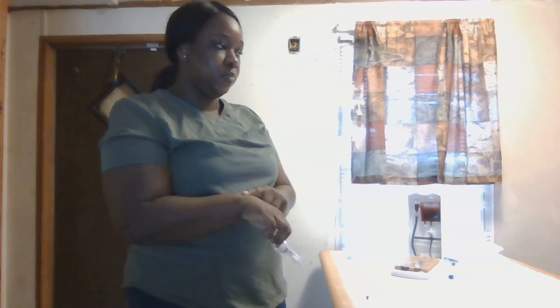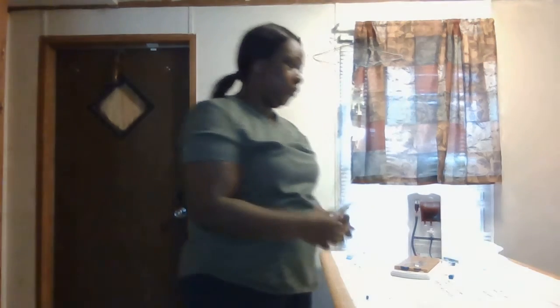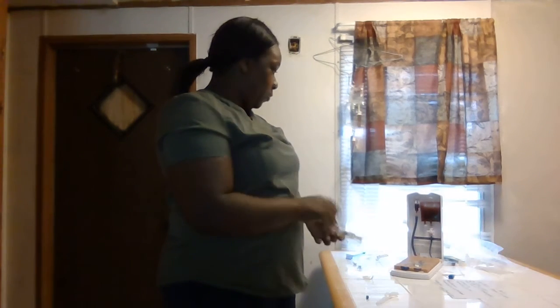Oh, and then when we insert the medicine, we have to use our watch to time the rate of insertion of the medicine per recommended push rate. So once we push the med, we look at our watch.